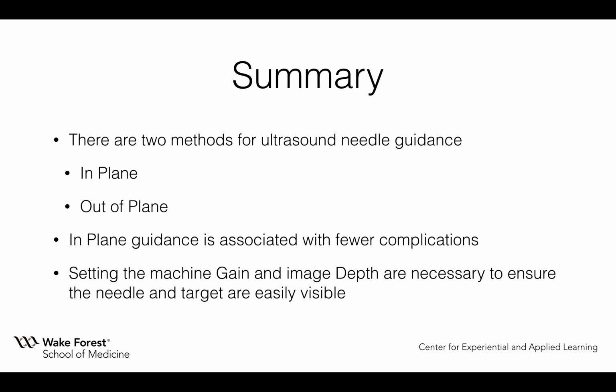It's important also to keep in mind that we need to set the machine gain and depth settings appropriately to get a nice contrasty image where our needle is going to be as visible as we can make it for our procedure. That's it for the Intro to Ultrasound Guided Procedures lecture.